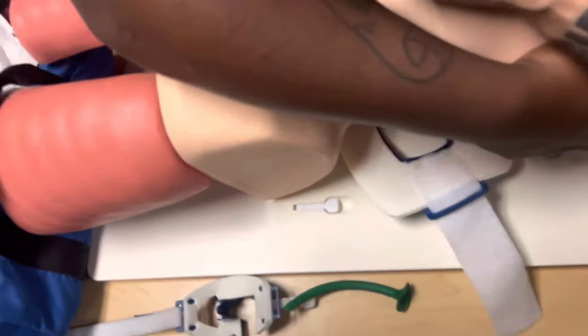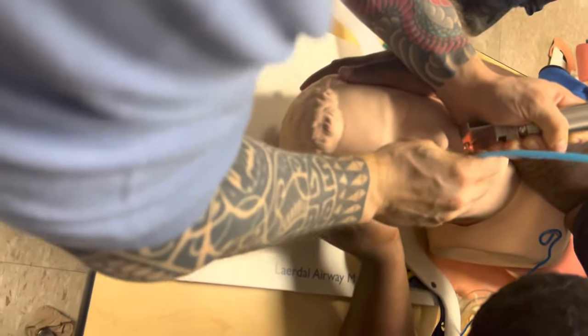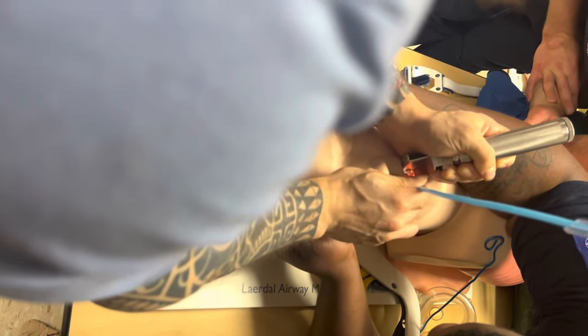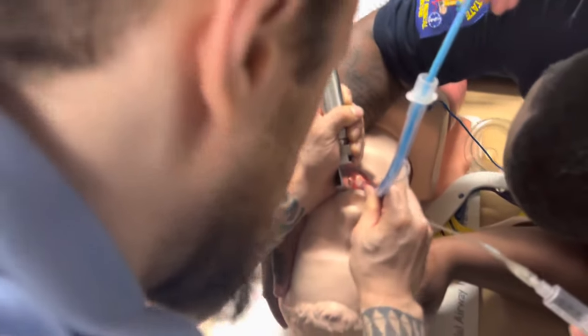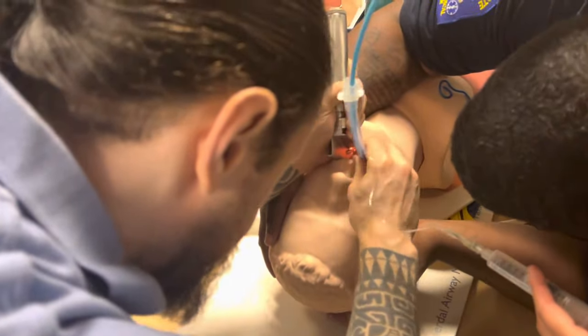I'm going to specifically show going to the esophagus - this can go all the way down. But what we want is it to be right in the trachea, and we're going to get holdup. How do I know I have holdup? It's not letting me advance any further. So I got holdup here - it's not letting me go forward. Then my partner is going to go ahead and introduce the ET tube. At this point I'm going to grab the top, I meet resistance, I hold the bougie, rotate it, and advance it forward.